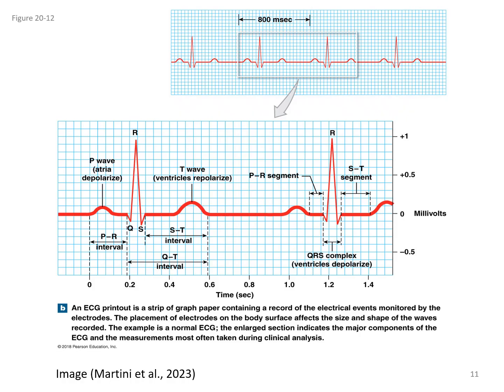All right, so this is what I was talking about. Okay, so right here, we were talking about the PR interval. And this is what they call a QT interval, which is the ventricular depolarization and then repolarization. Okay, and then right here the PR interval, which means the atrial depolarization, and whenever the PR interval is delayed, like it has more than 200 millisecond, then it is said that there is an AV nodal delay.